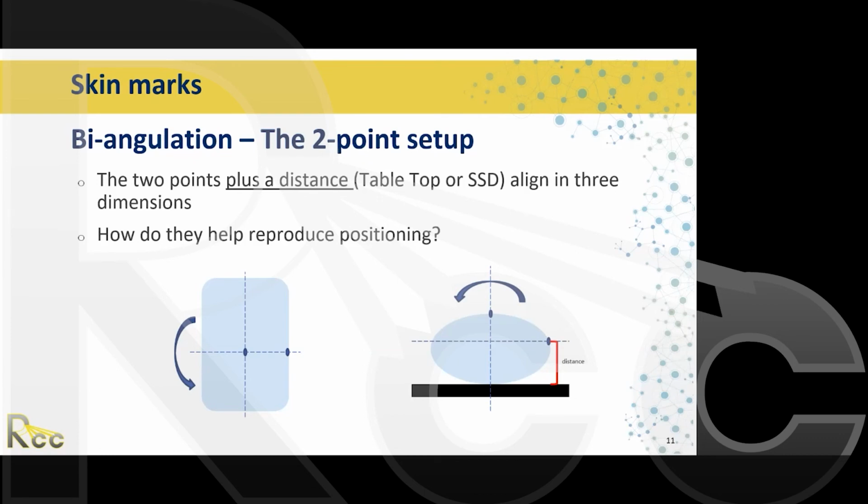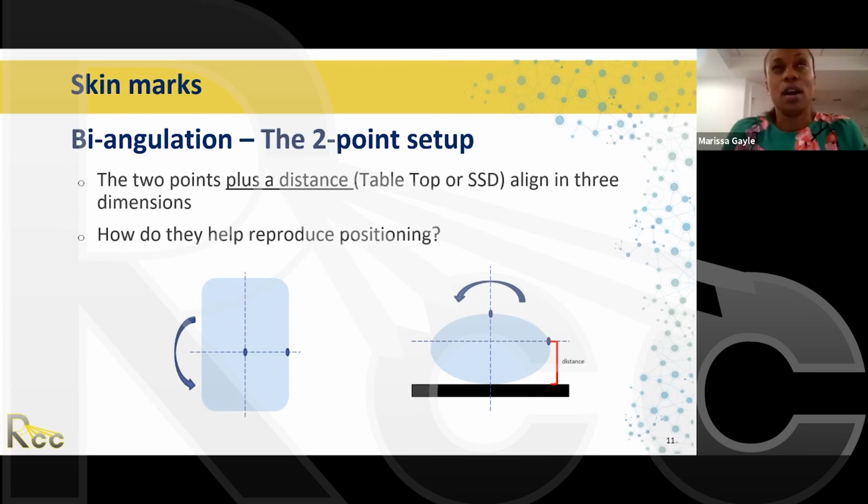Thank you. In head and neck cases, how much contrast do you give? I'm trying to remember the size of it, it's preset. So we have preset bottles that we upload into a syringe and then it is pushed. We push the contrast, we wait maybe a minute, and then we start to scan.